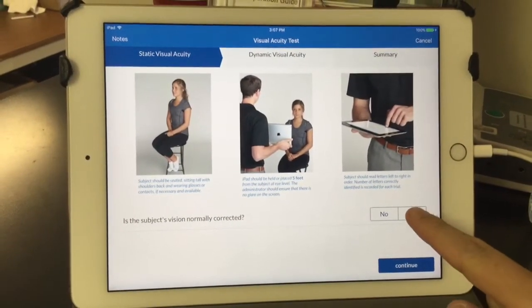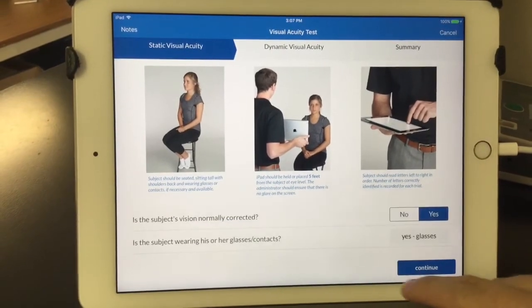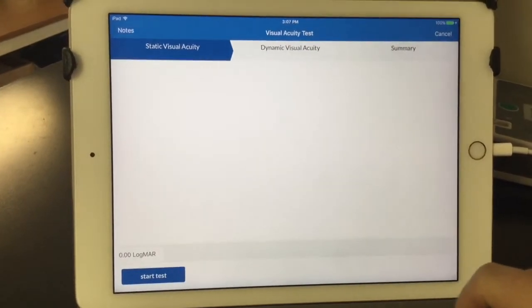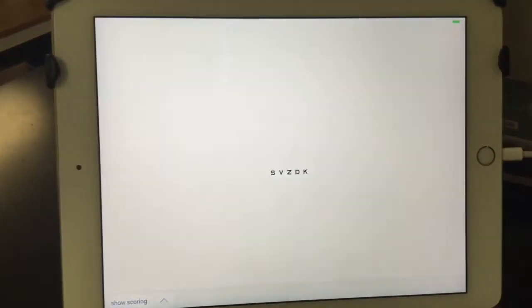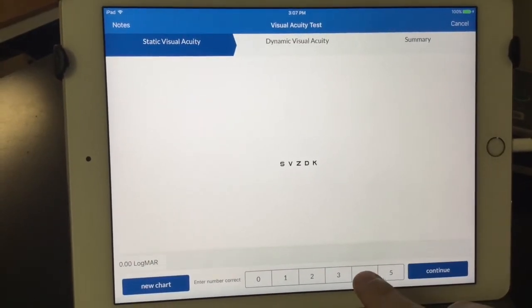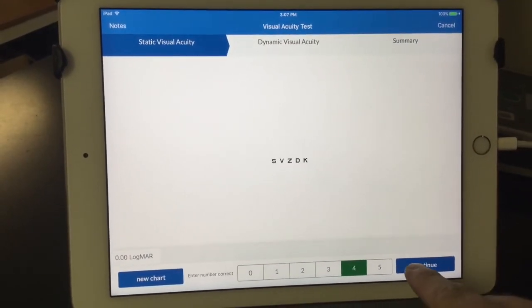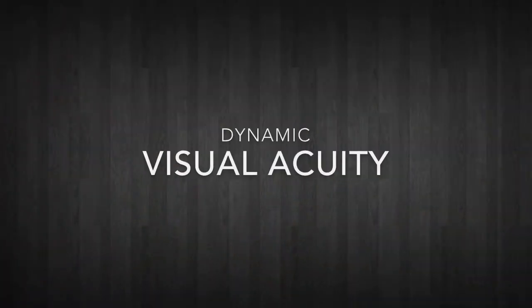Athletes will then be tested on their visual acuity. Very similar to when reading lines at the doctor's office, your job will be to record the correct amount of letters the athlete says right. Once the athlete is finished, you will click Show Scoring and click on the correct number the athlete got right. You will then click Continue, and a set of smaller letters will then appear. You will continue this process until the athlete can no longer see the line.